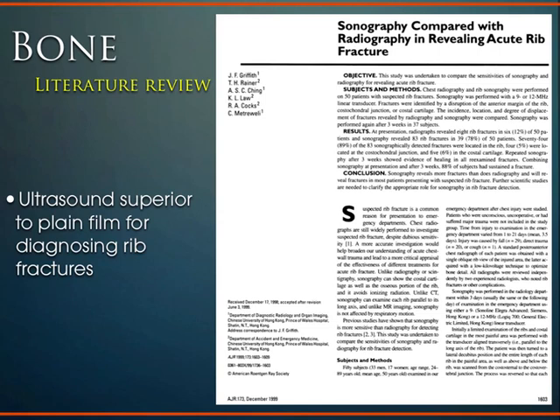I'll show you some more images of that, but when you look at the literature, because it is a new modality for imaging in MSK, a lot of people are trying to study this and make sure that we're not just assuming what we can see, making sure we're comparing to standard of care, whether it's X-ray or MRI or arthroscopy, making sure that what we think we're seeing, we actually are seeing. Most of the studies that are coming out are showing quite a benefit to ultrasound, and that it's either as accurate or in some cases even more accurate than some of our traditional modalities.